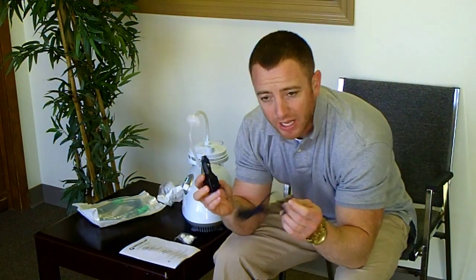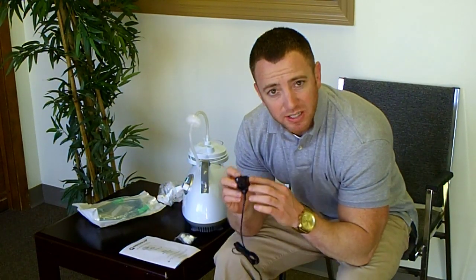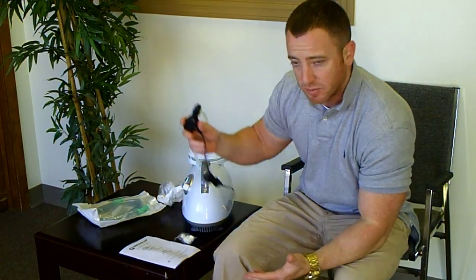The next thing you're going to have is a car charger. Now this has a fuse inside, so I only want you to use this while you're sucking because it could blow your fuse, or it could also overcharge your battery and ruin your suction machine.